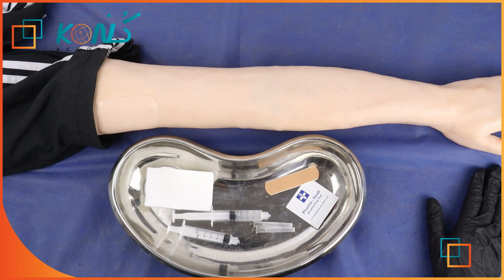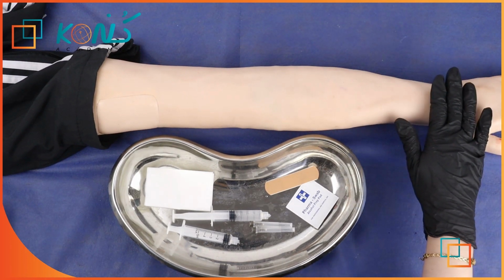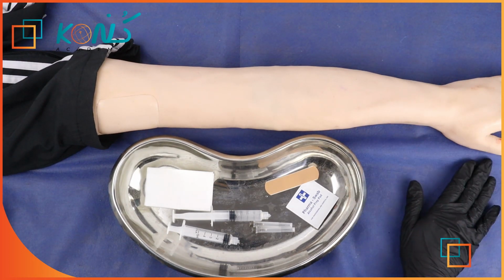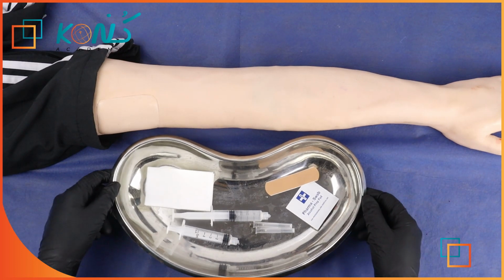By that, you can say, I need you to expose your arm if you are going to give it in the arm. And also, I need you to put your hand on the table, and then you will do the procedure with your colleague.